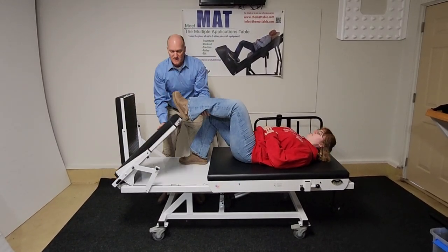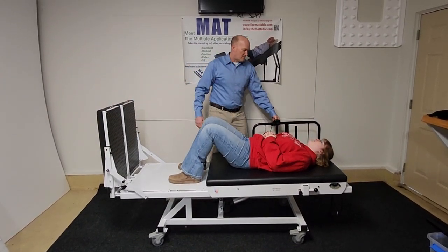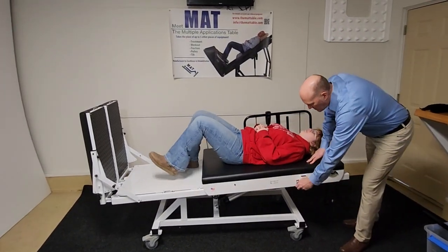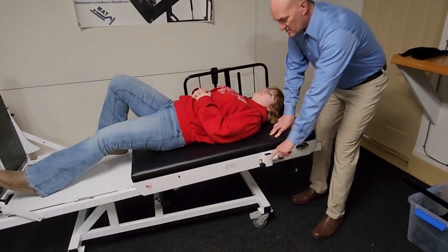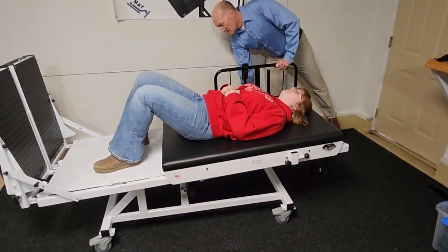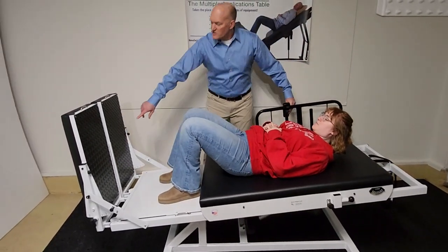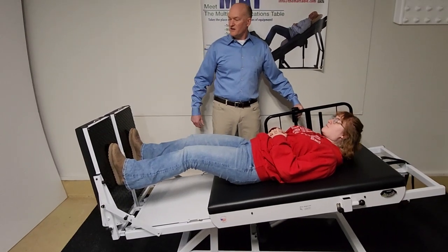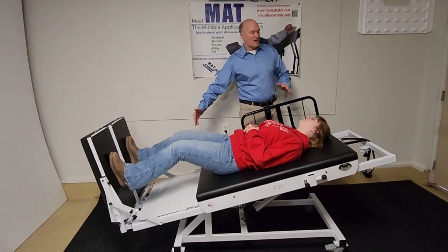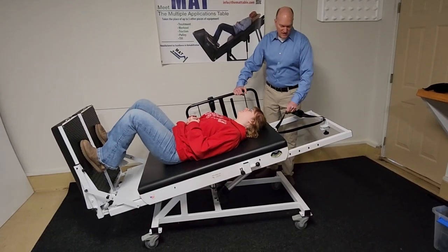Go ahead and lift this leg. The rails just snap right in place and you raise the table to your desired level. There are two brakes — they're both on right now. You simply twist that into the movable position and there's one over here that's similar. You position the patient where you want them for the exercises. You can put your feet anywhere on the foot plate. There's an internal welded brake that will only let the sliding mechanism go so far — there's the brake for donning and doffing, getting on and off the table.